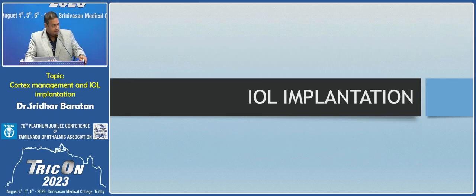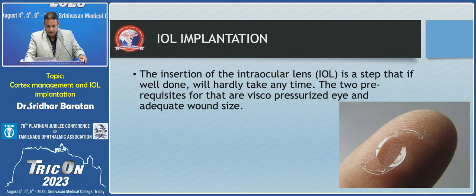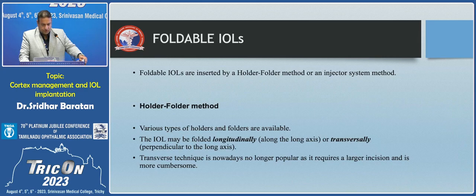Coming to intraocular implantation, the insertion of the intraocular lens is a step that, if well done, will hardly take any time. The two prerequisites are a viscopressurized eye and having an adequate wound size. You could use the holder folder method, where various types of holders and folders are available. The IOL may be folded longitudinally along the long axis or transversely.